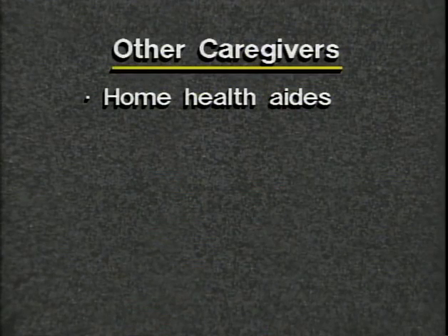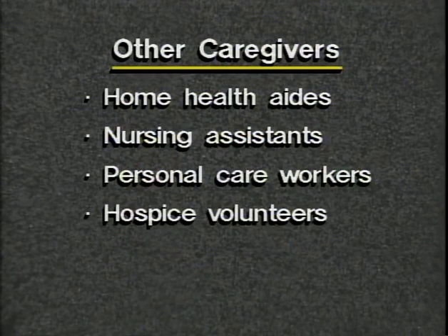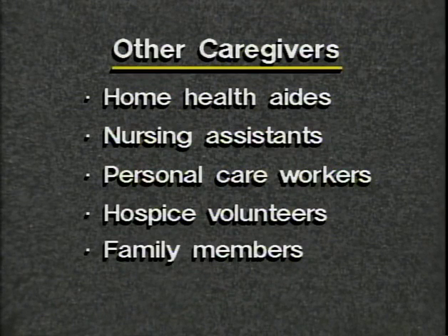As more complex therapies move into the home, the need for education about the care of the patient with a pump becomes increasingly more important. Because of the nature of the patient's disease or injury, these patients often require assistance with personal care needs. Even though the registered nurse remains responsible for the therapy and medication, other caregivers are entering the picture. Home health aides and nursing assistants, personal care workers, hospice volunteers, and family members are called upon to meet the patient's needs without interfering with the pump and therapy.